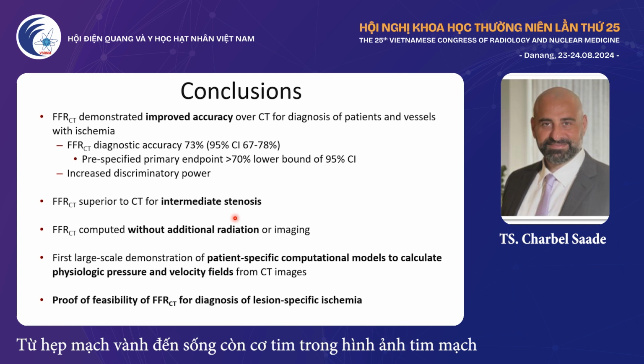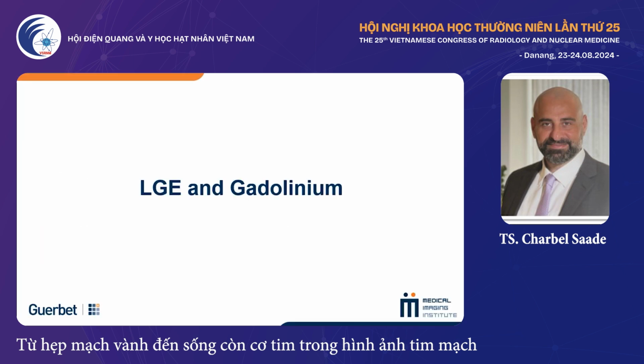So CT is just not enough anymore. We need FFR. Now, it's also done without any extra radiation dose. And of course, the feasibility of lesion-specific ischemia has been demonstrated. We know that we have stenosis, we have CT FFR, but sometimes this is not available.